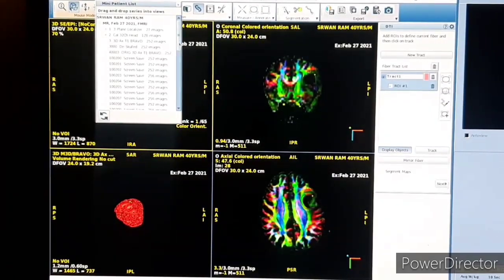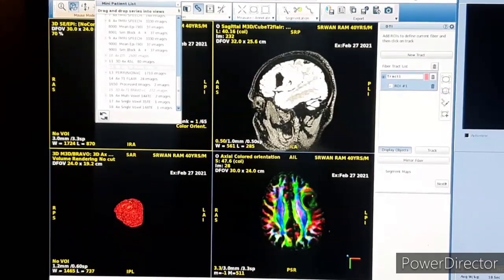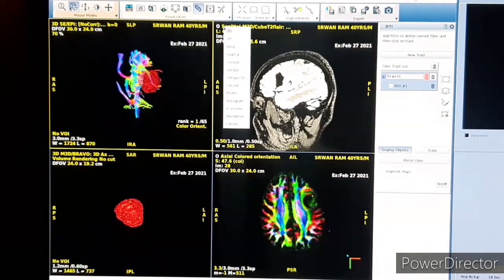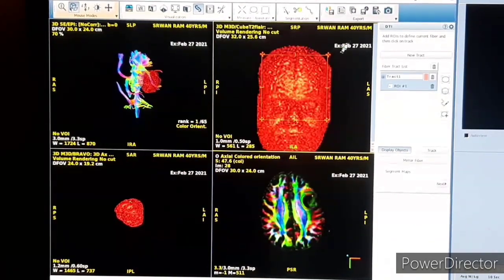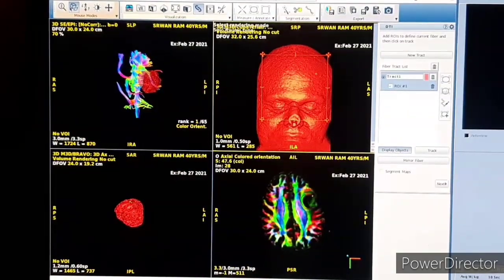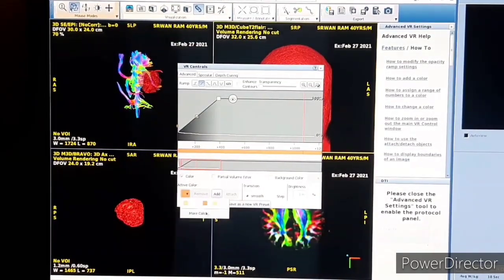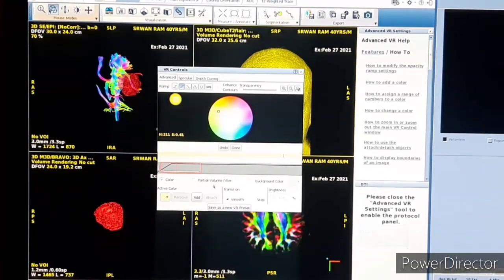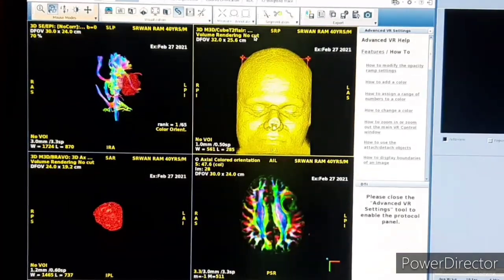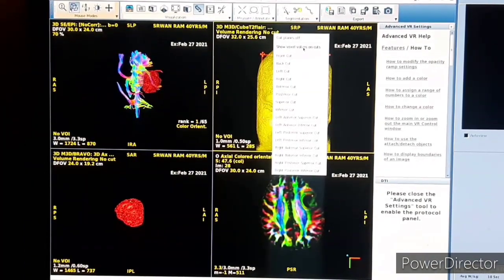Then in the coronal image view, you drag any 3D sequence — I drag the FLAIR, and this FLAIR is converting to 3D VR. Then adjust the color to make the proper skull or face. You can also go to the VR setting and choose different colors for the 3D skull or face.